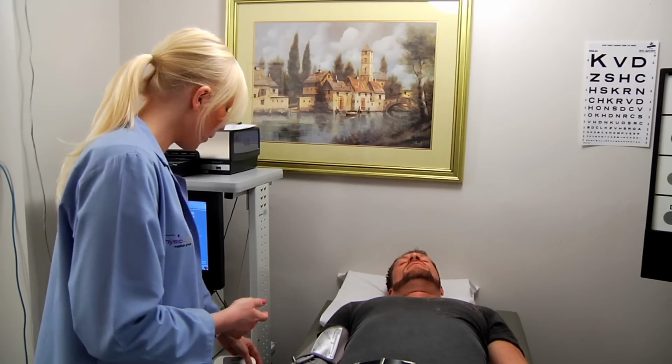It's been 10 minutes, the patient's rested. I enter the room, the lights are still off, and I come right over to the patient and I tell them to continue to relax. I'm just going to start the blood pressure cuff. So I'll do that right now.